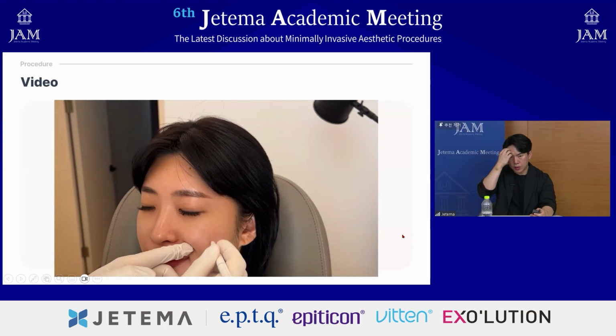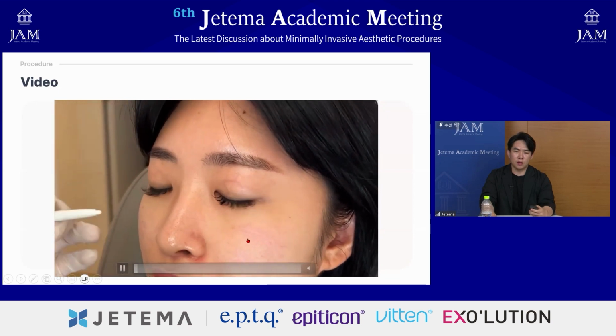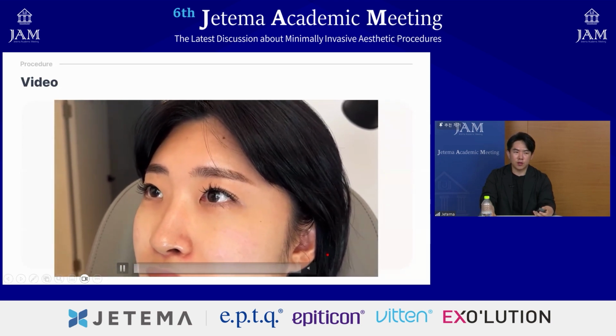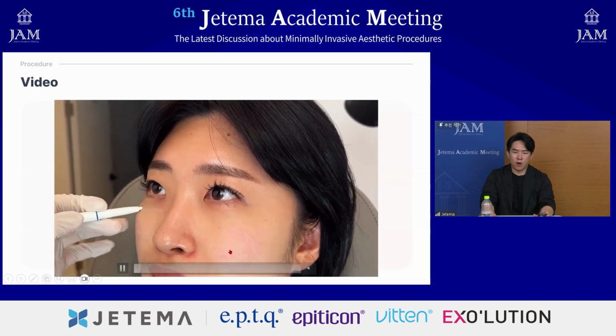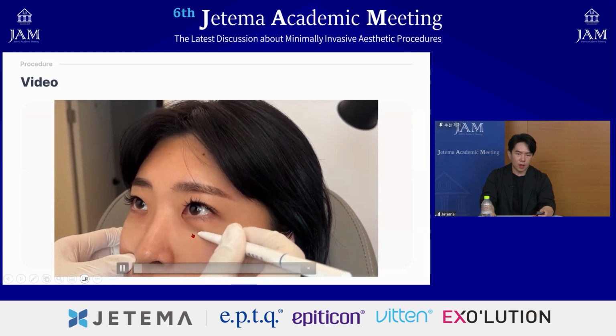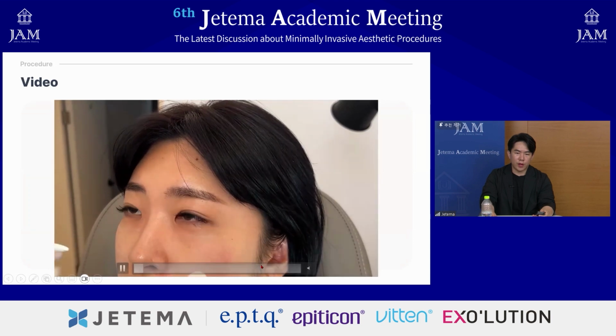Before the procedure, I mark where the hollowness is, and I make my patient laugh a little bit, because when the patient laughs, they look a little bit younger, and so I can see where the volume is the most. And now I'm marking where I will be placing the thread.